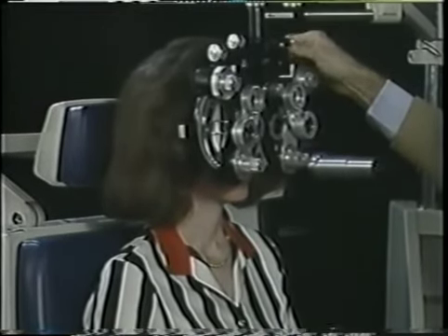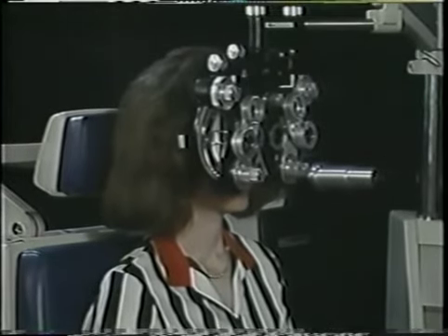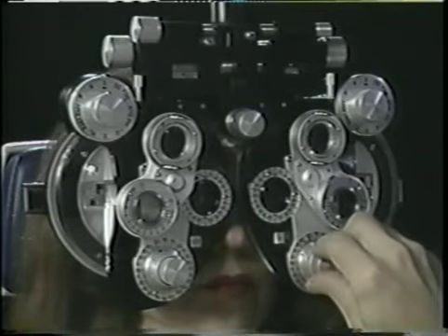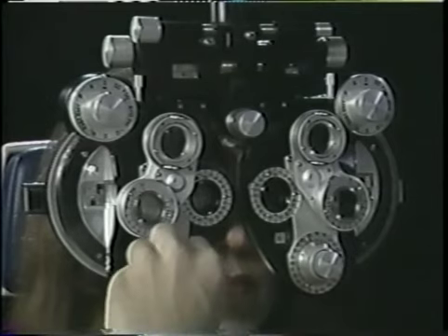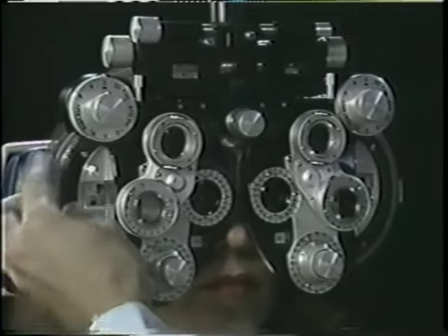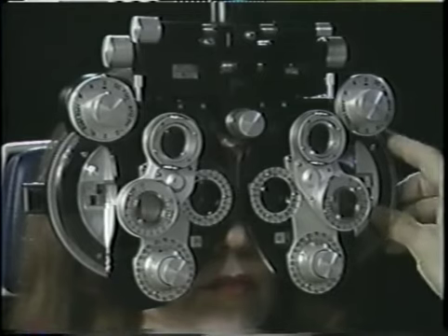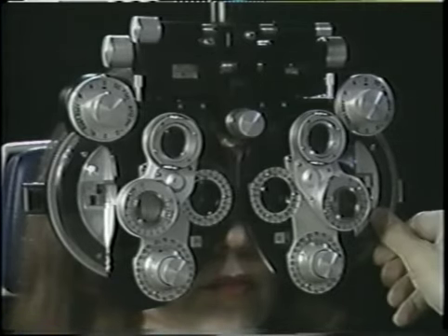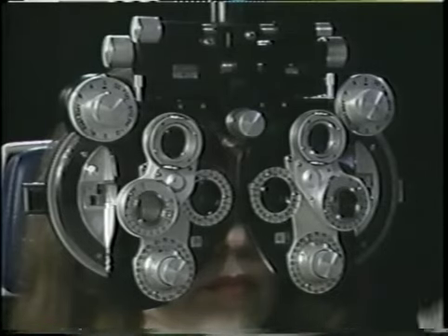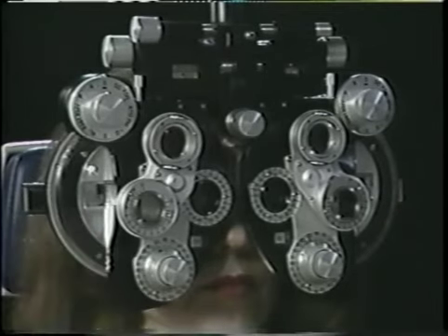The phoropter is first placed in a comfortable position for the patient, with both eyes open, and the interpupillary distance set to center the patient's eyes in the apertures. The lens dials are set to 0 cylinder and plus 1.5 diopters sphere on both sides. The plus 1.5 diopters of sphere place the emmetrope's far point at the normal working distance. Also, this plus sphere power makes most patients myopic, fogging the distance fixation target and tending to relax accommodation. If the patient turns out to be more than 1.5 diopters hyperopic, more plus sphere may be necessary for proper fogging.